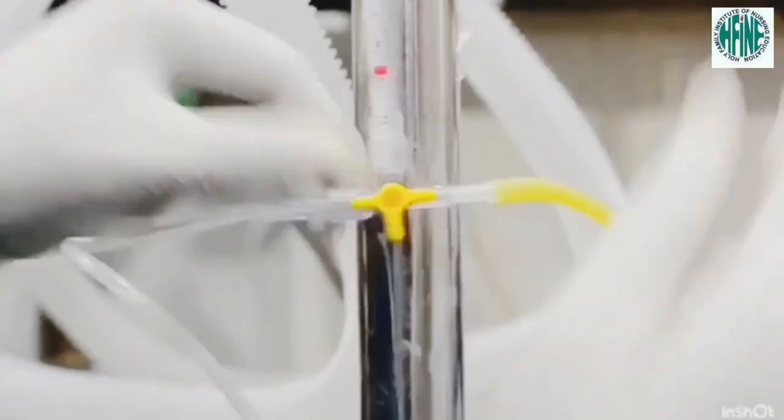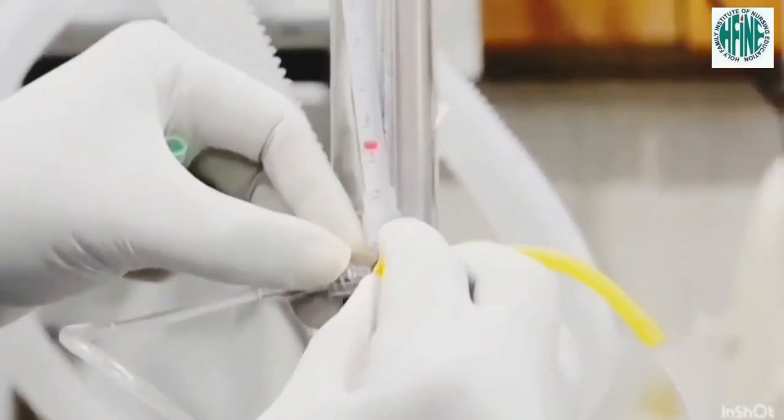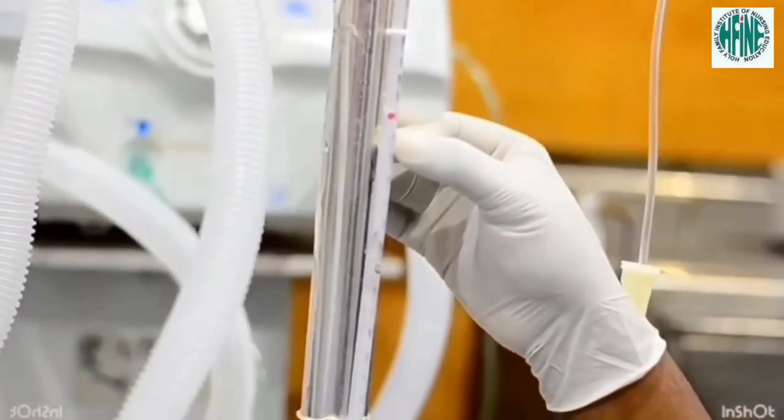Turn the stopcock off towards the client and fill the manometer with normal saline to the 20 cm mark above the anticipated reading. Hold the manometer at the phlebostatic axis and turn the stopcock off towards the normal saline. Watch as the fluid falls in the manometer and take the CVP reading when the fluid stabilizes.